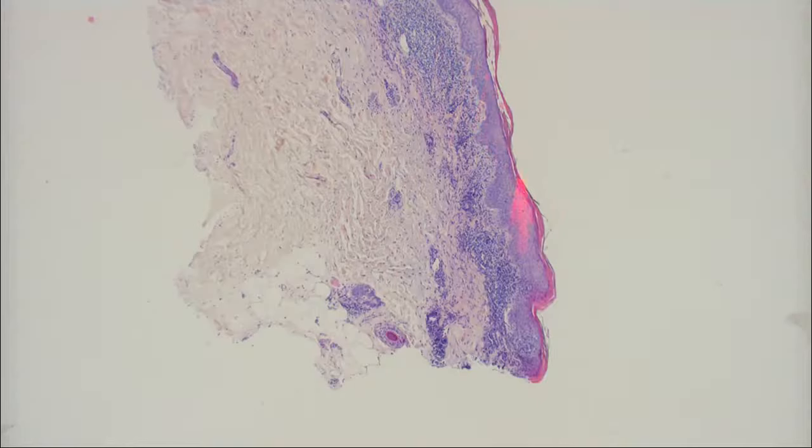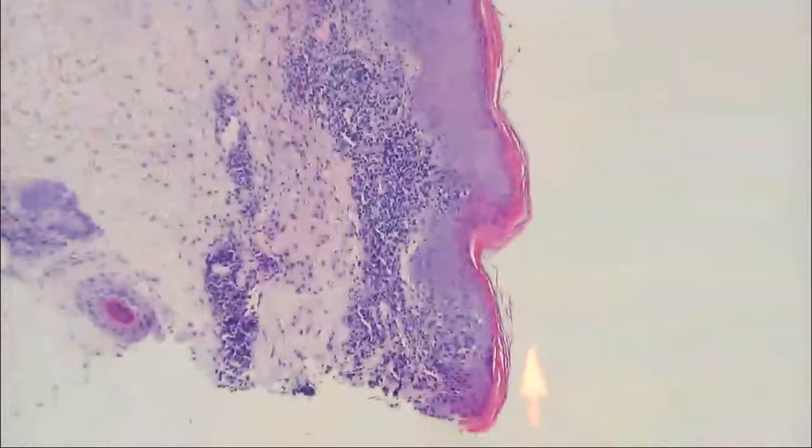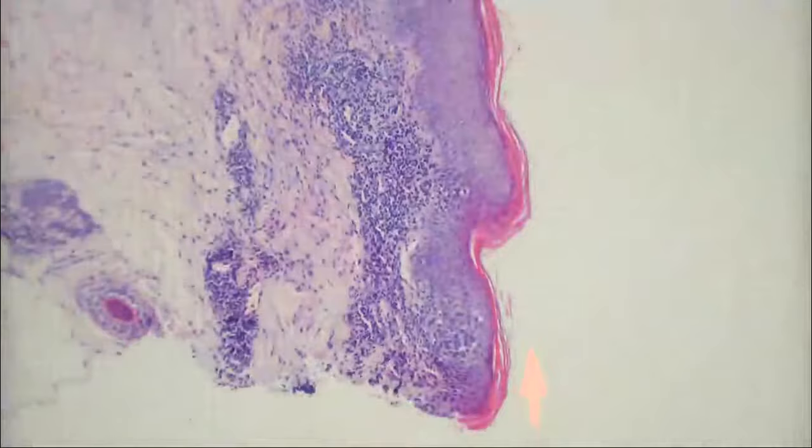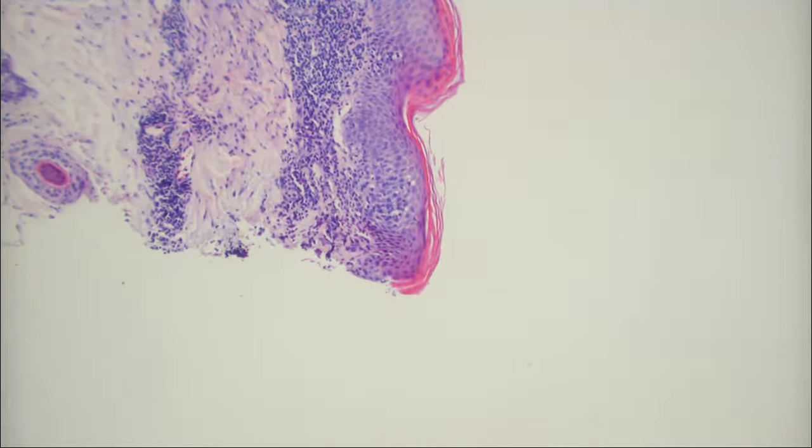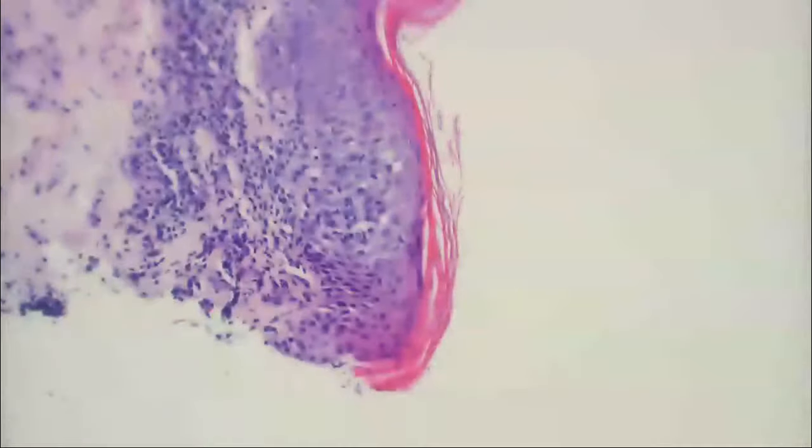I didn't know that particular distinction. And it's also got some other stuff going on here, too. Yeah, there's some epidermotropism, a little bit. Also, what's this change? So we just had ballooning. What's this change? Spongiosis. What about the cornified layer? There are slight areas with parakeratosis. Anything else?